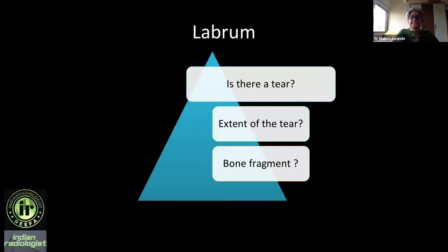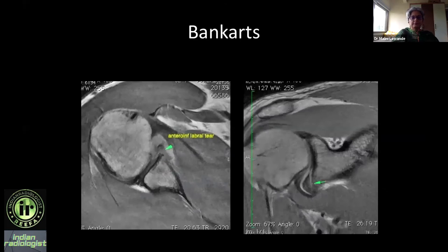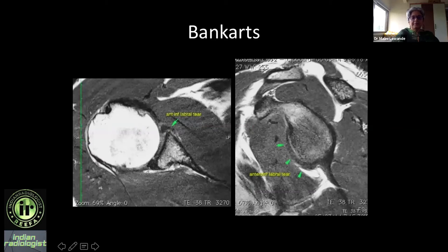That's what the surgeon wants to know. Starting with the labrum: is there a tear, what is the extent of the tear, how big is it, and is there any associated bone fragment? You can clearly see an anterior inferior labral tear here; this is the intact posterior labrum. This is a Bankart lesion in a patient who has had anterior dislocation.